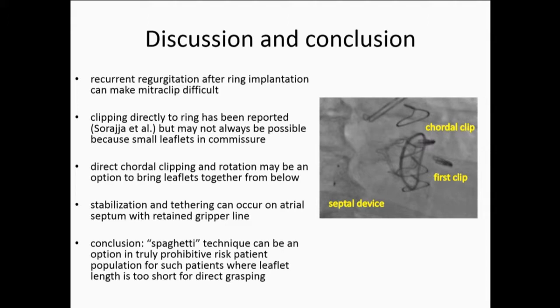You've already rotated up all your ports. Why not rotate? So Mike, she's 87. I'm a little worried. I'm glad it worked out. I'm worried that rotating would cause an abnormal stress and they would break. Absolutely. The first 6 months. I'm glad they have it. I mean, who knows? I've never done this, so who knows?